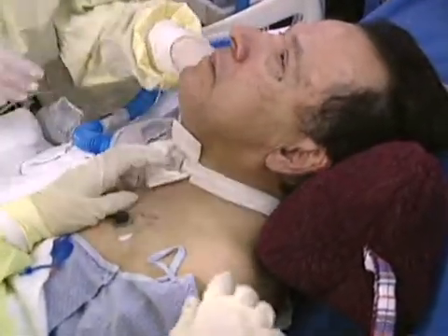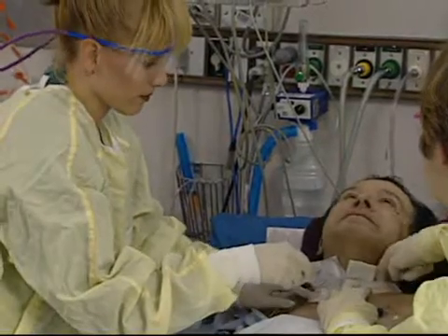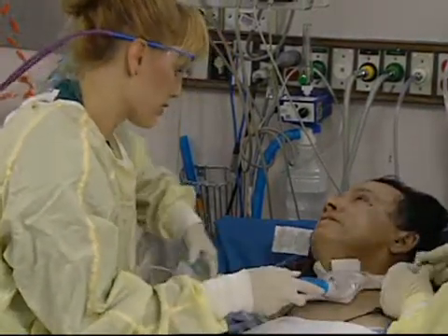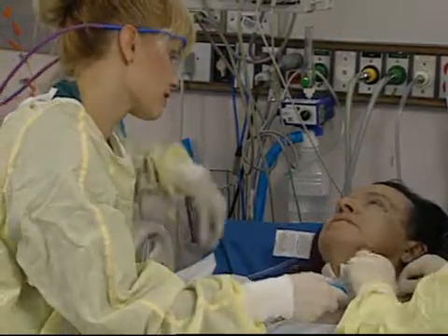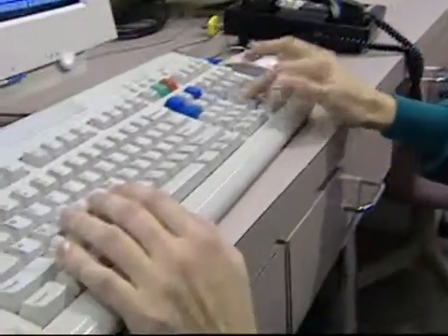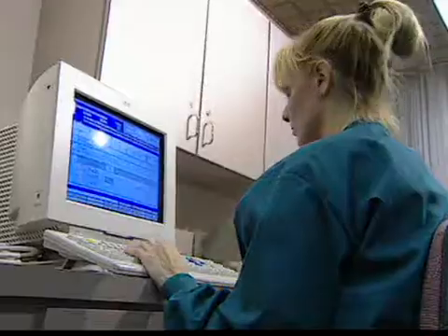When tightening ties, be sure you can slip a finger between the tie and the patient's neck. And let's snap that back down for his trach collar. Do you need suction, Mr. Gonzalez? Document the procedure and note any signs of infection or skin breakdown in the patient's record and nurse's notes.